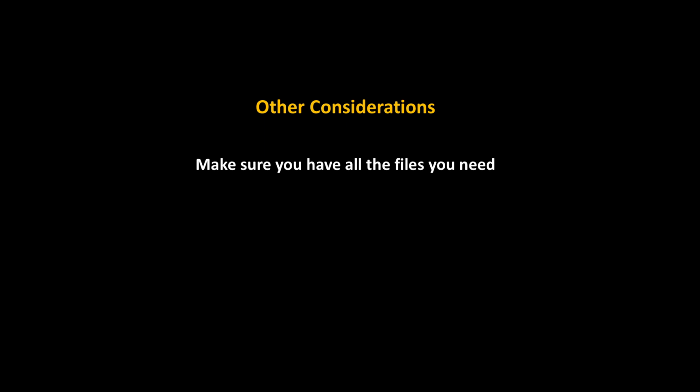More common than you think. Some people will collect an entire study before they even look at whether their onsets were right. And if they're not right, we have a program which can fix all that. That's a joke. You're screwed. You can't do anything about that. So make sure that that stuff is there, because if it's not, we cannot do anything about it.